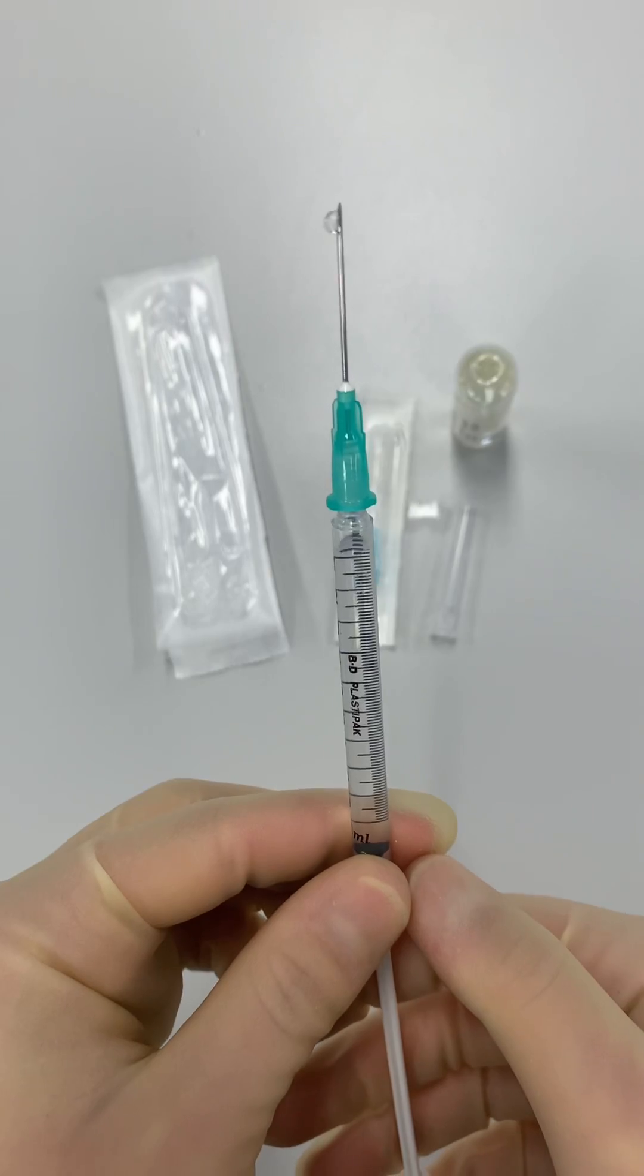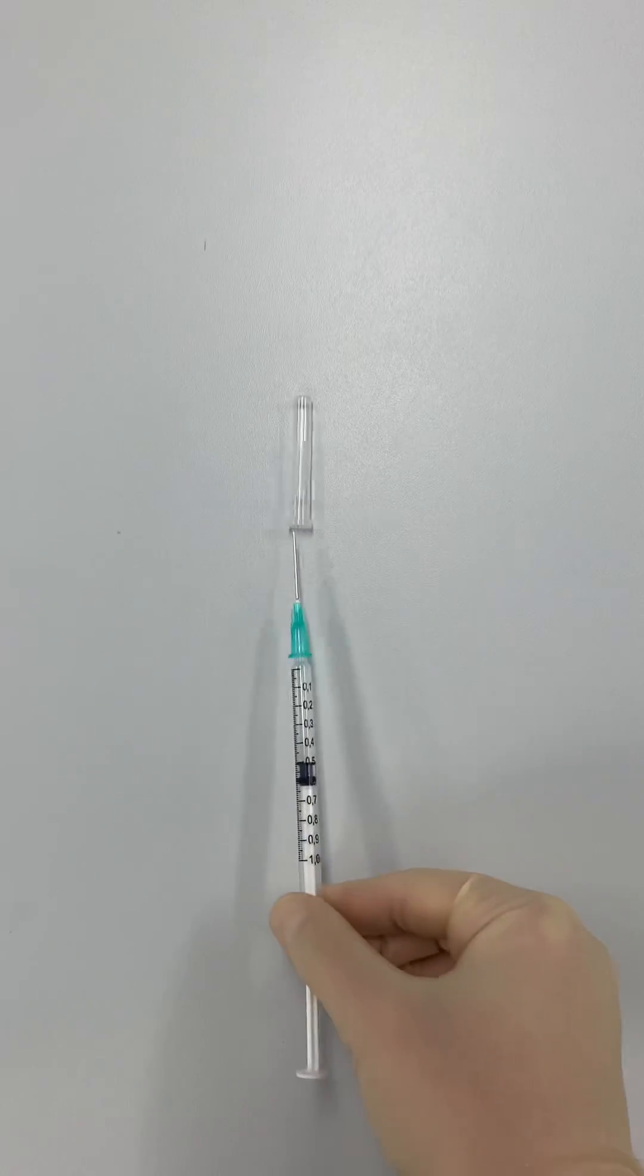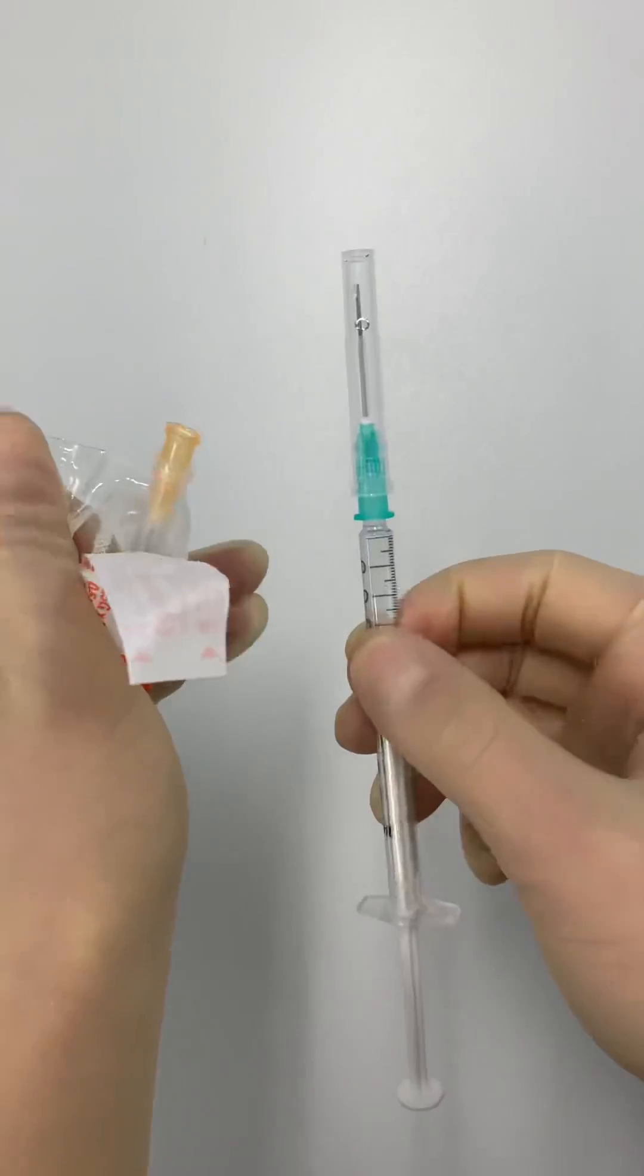Then empty the syringe until you're left with the required dose. To recap the needle, put the cap down and slide the tip of the needle into it. Now all you have to do is change the needle and you're ready to inject.